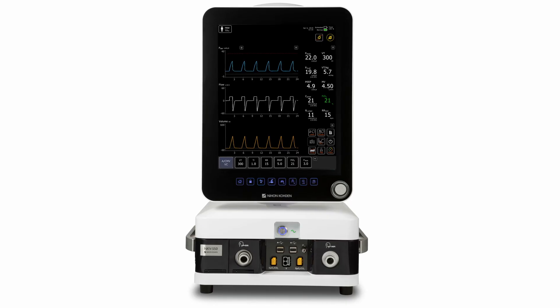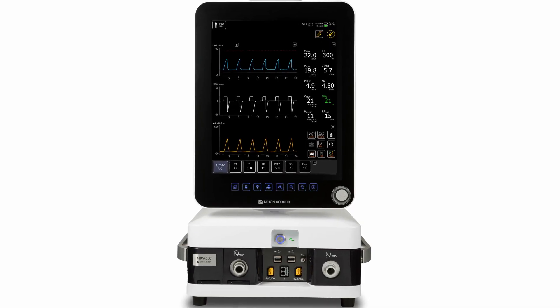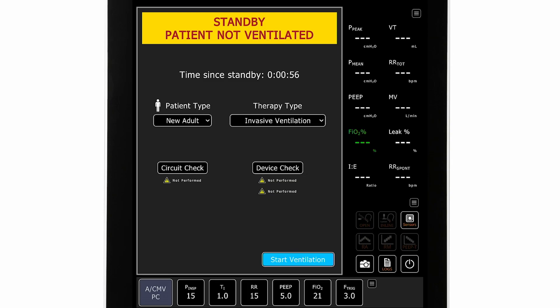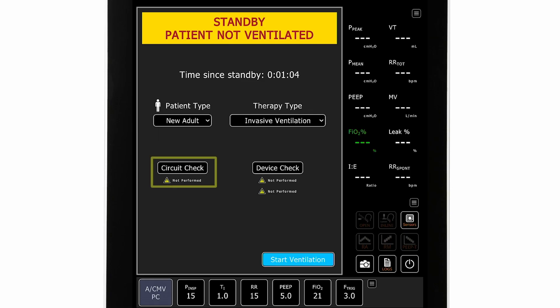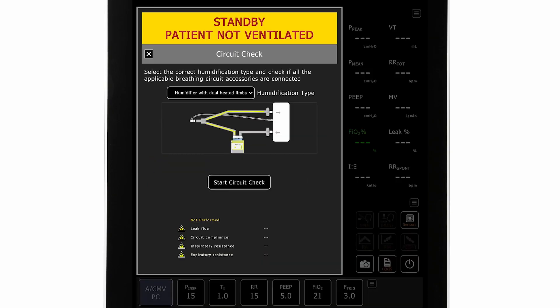When the ventilator is powered on, the startup screen will be displayed. On the startup screen, the clinician selects the patient type, the therapy type, and clinicians can also perform a circuit check or device check. On-screen instructions guide the clinician step-by-step through the testing process.